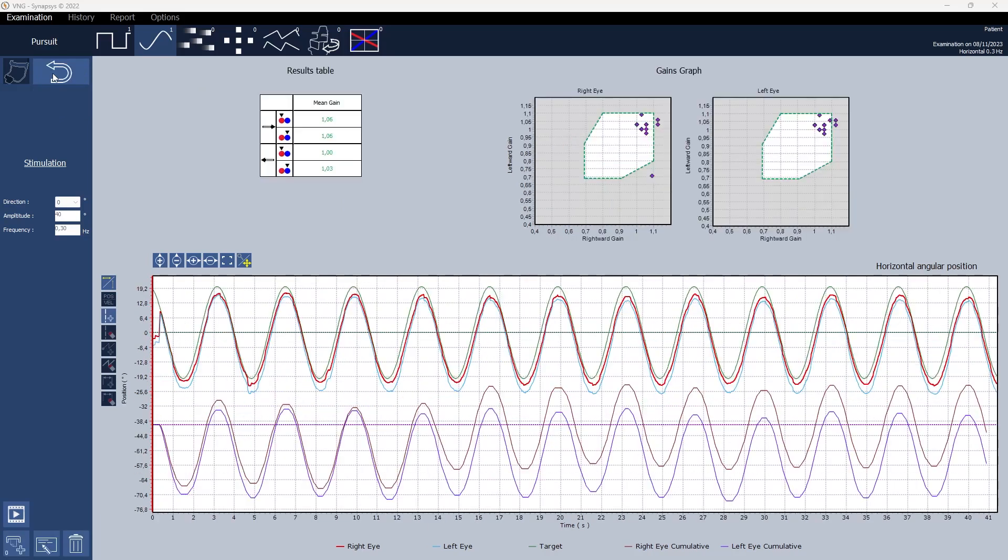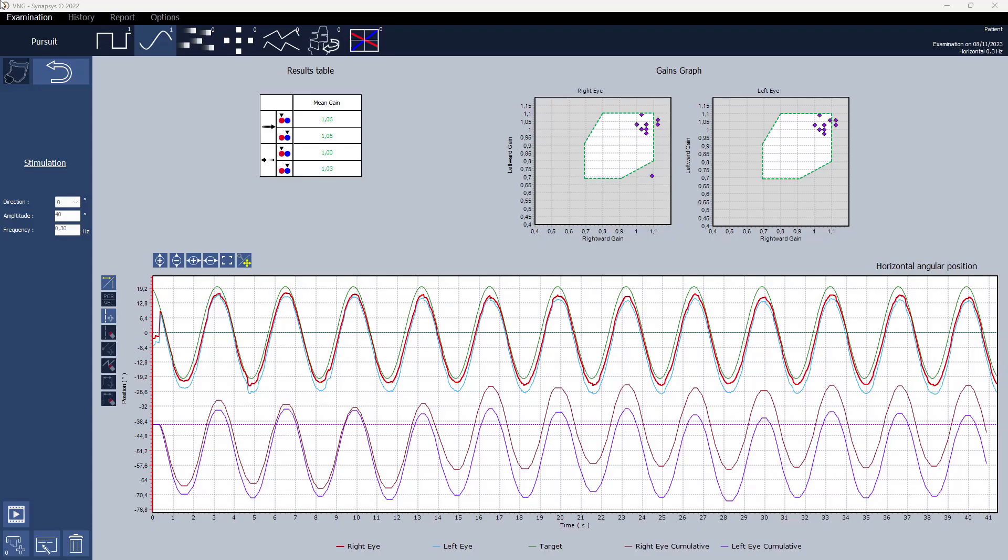In the upper right segment a gain graph is shown highlighting individual gains through distinct dots for leftward and rightward movements. Additionally, the results table presents a comprehensive summary of average gains for both rightward and leftward eye movements.